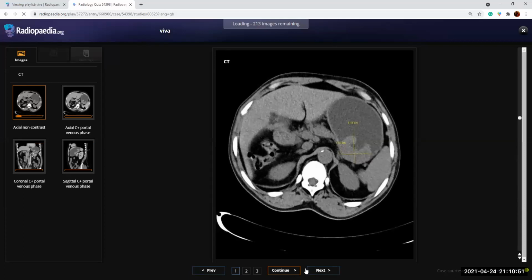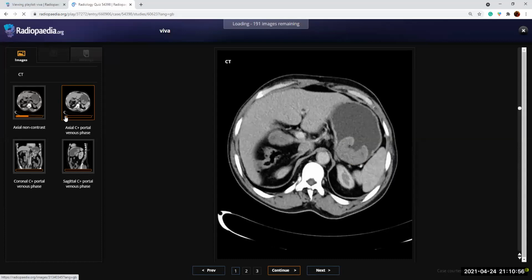Yeah, this is a patient. Okay, I shouldn't have shown the sequence. So this is a patient who has had anemia. This was a case of evaluation for anemia.